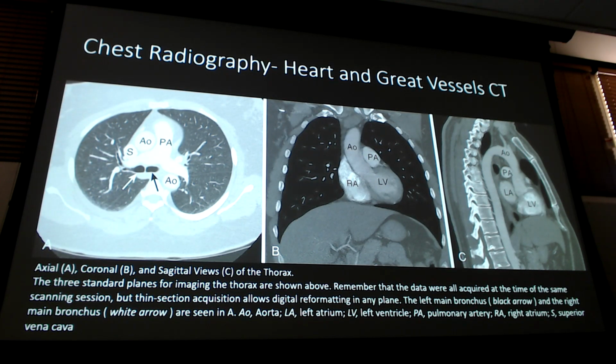But that pulmonary artery is extremely important because when we do these scans, this is where you're looking to look for a pulmonary embolism, primarily in the pulmonary artery. Why? Because I can deal with emboli down in here, little clots in these smaller vessels. See how they're branching out like little spider webs? These are all the blood vessels going out throughout the lungs, bringing blood to it. I can deal with small little clots in there. It's going to cause some pain, but that's not going to kill the patient. You get one in here that stops blood flow, it's night-night time.